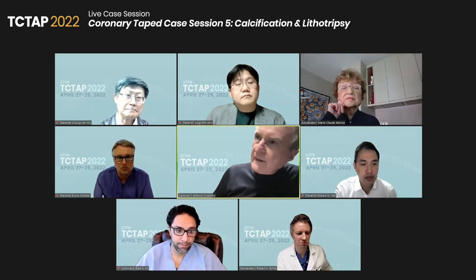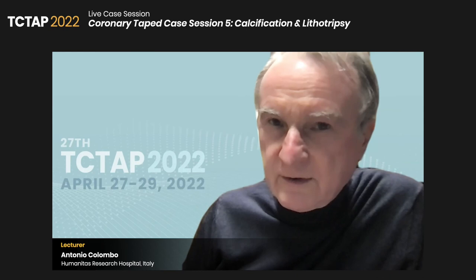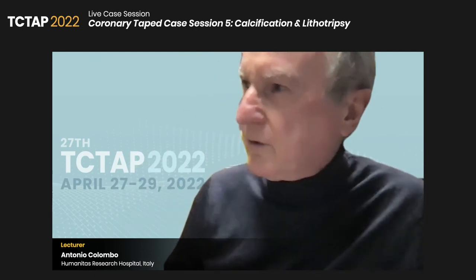I have a question for Ziad. Sometimes when we do extensive preparation, shockwave and high pressure balloons, we're a little bit afraid to do OCT at the end before stenting, because we had some cases where we had some pretty bad propagating dissection due to the contrast media injection. What do you think? Were we unlucky, or is it something to be concerned about?